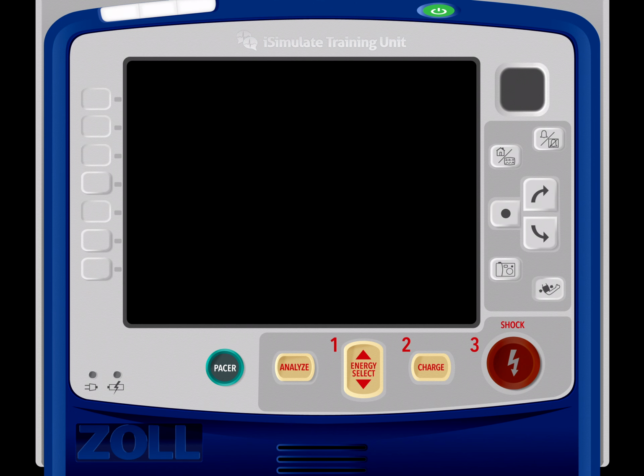All right, so we can't ever have any gaps where we stop CPR, because remember, just like documentation, if you don't document, it doesn't happen. In this station, if you don't say it out loud, some of these things don't happen. So if you're not able to physically manipulate the cardiac monitor to do something, if it's something that we're verbalizing like CPR, you have to make sure that you are verbalizing the starting and the stopping of CPR as appropriate.